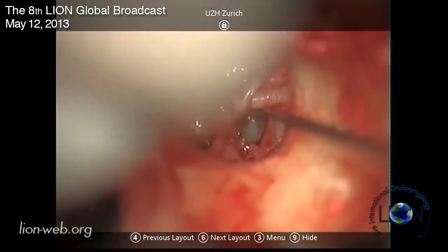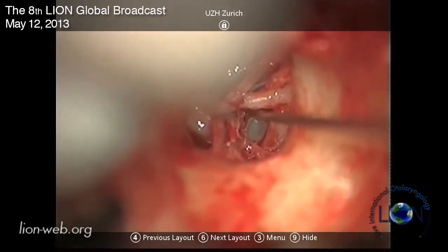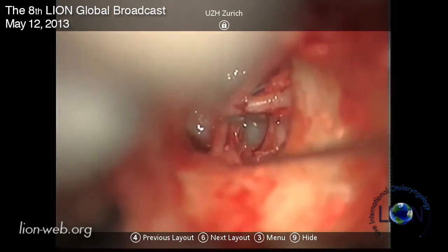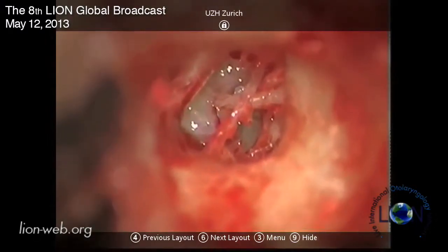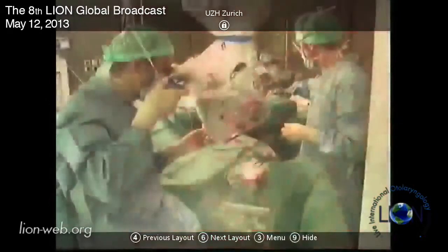You can nicely see the footplate here - we've got a pretty good view actually. It's completely fixed. So what I'll do now is go and cut the incudostapedial joint. Excuse me, I have to move the microscope.